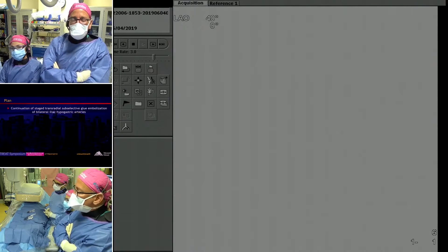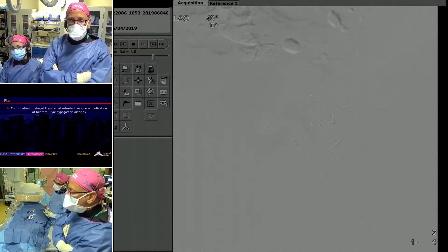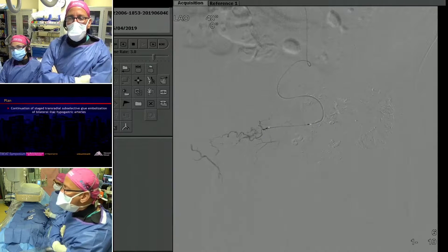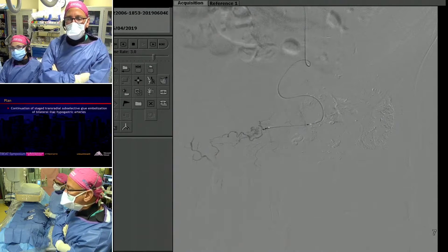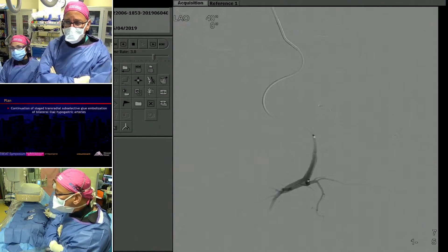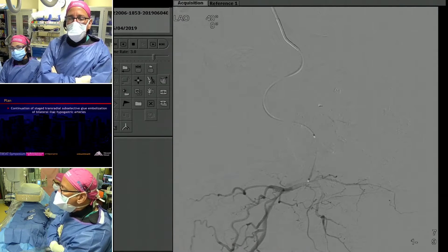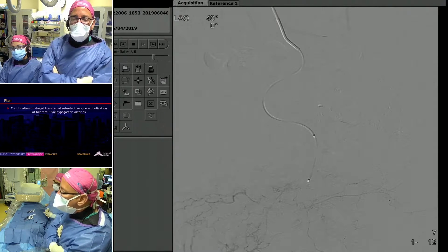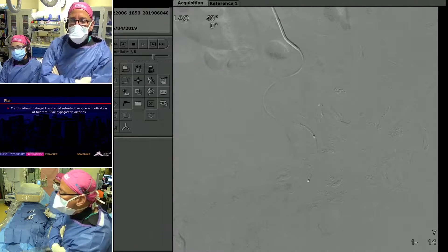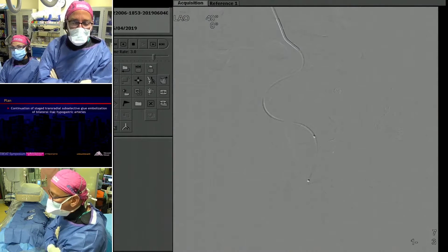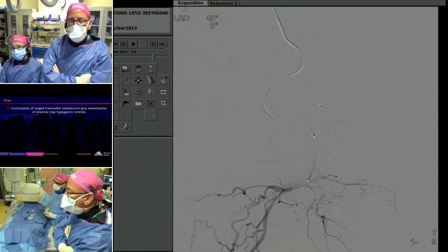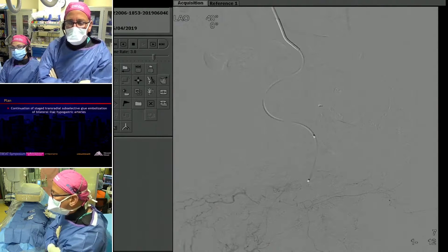Here's another branch, and there's absolutely no shunting here whatsoever. Same branch, just a little bit more proximal — again, no shunt that would be worthwhile to treat or that would do anything to improve this patient's symptoms.